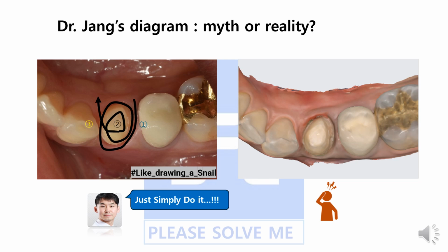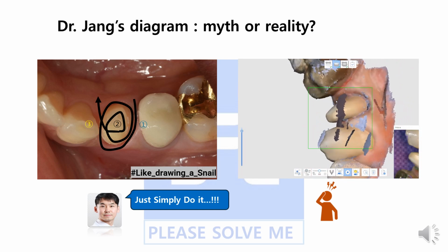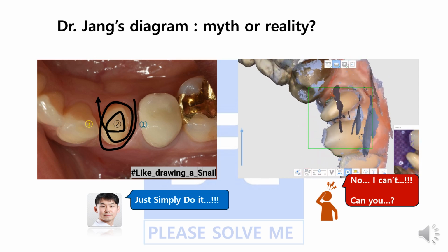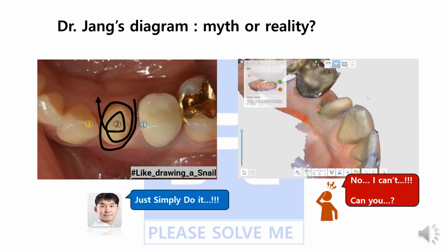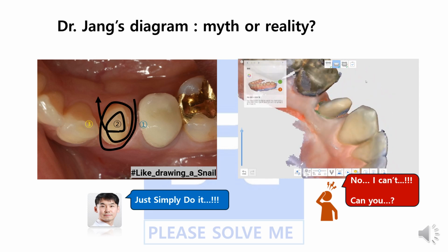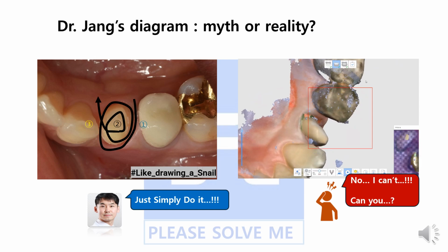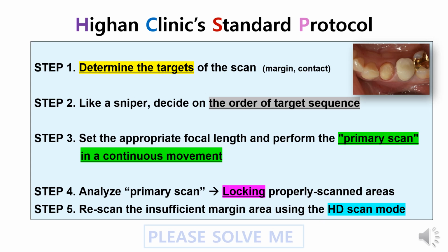There is a lower chance that layering occurs, because we scan in a 3-dimensional motion, so some points or lines could overlap, and layering is hard to avoid in some areas. In addition, in order to achieve sufficient data of the green color in the reliability map, rolling motion is required, but if the motion is excessive, layers may also occur. We need more than just a diagram to standardize the scanning sequence. So, we made a protocol that every staff member can understand.